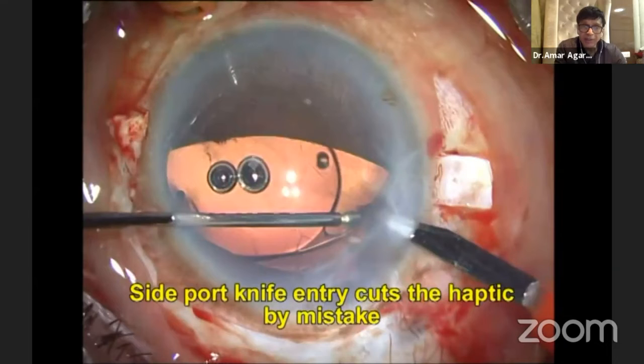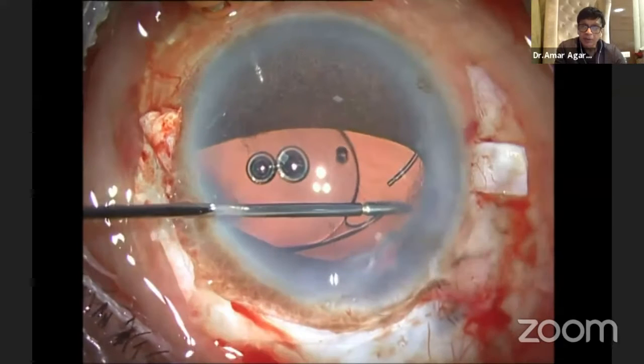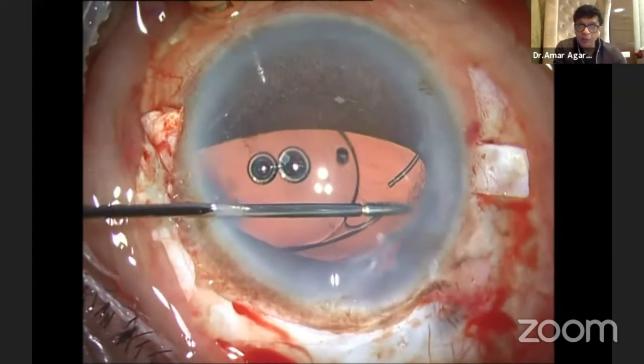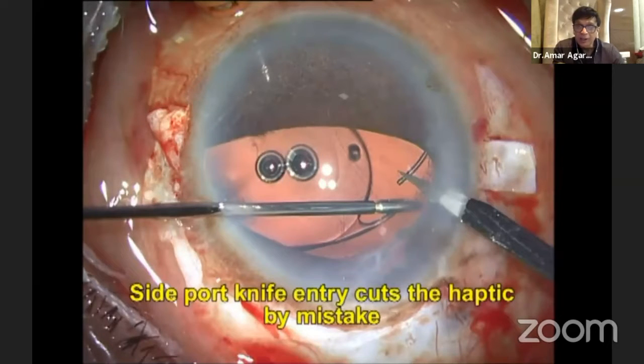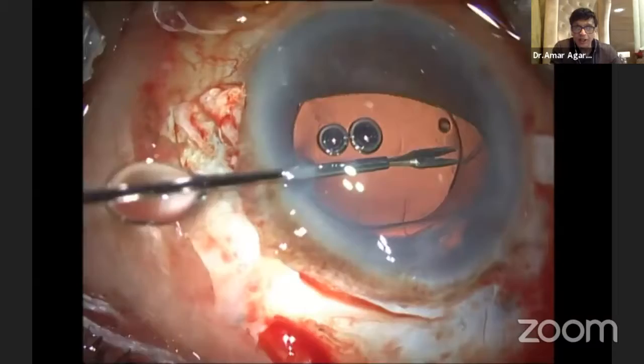So I thought, let me make my side port incision. And Hari Priya, you showed some nice one showing cutting of the cornea with that knife. I'm even worse — I cut the haptic with the knife. I'm showing you how the knife, which I wanted to use to make my incision, has gone and cut the haptic.